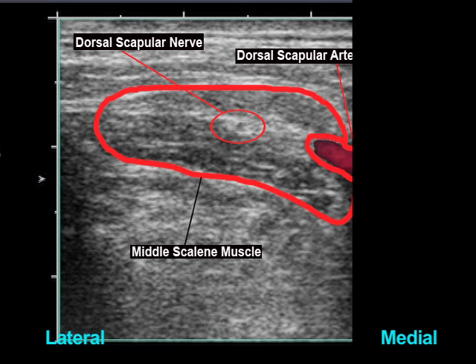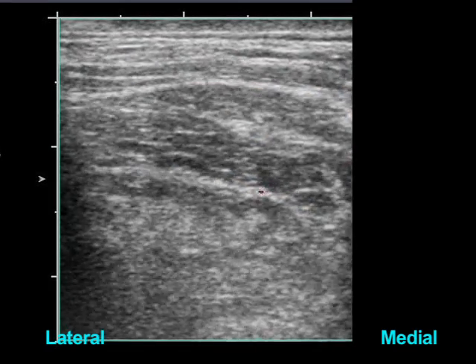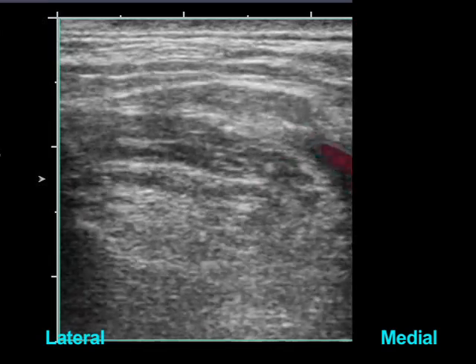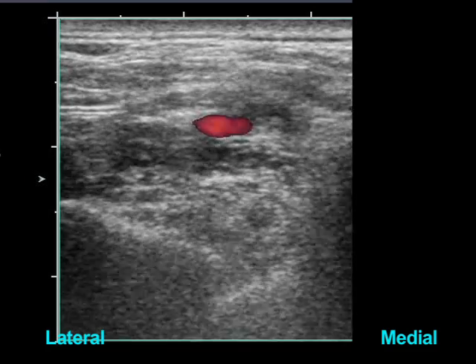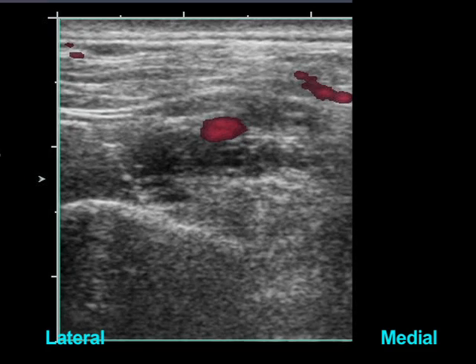The dorsal scapular nerve is the first nerve that can be identified to leave the brachial plexus. This nerve usually passes through the middle scalene muscle and will eventually join the dorsal scapular artery. The dorsal scapular nerve flattens in shape as it enters the middle scalene muscle. The dorsal scapular artery divides the middle and inferior trunks of the brachial plexus.